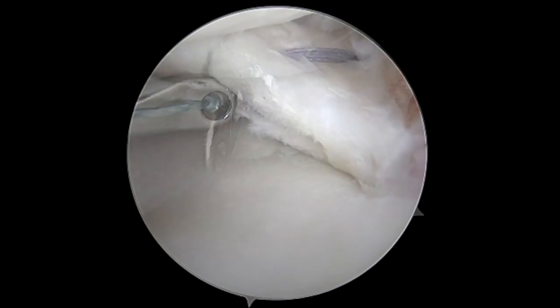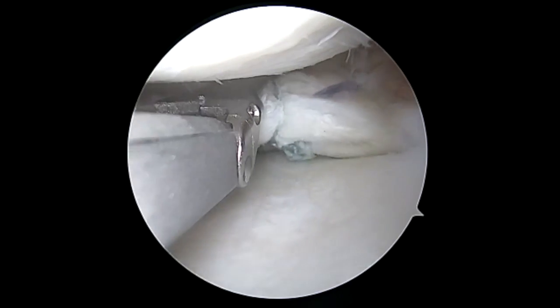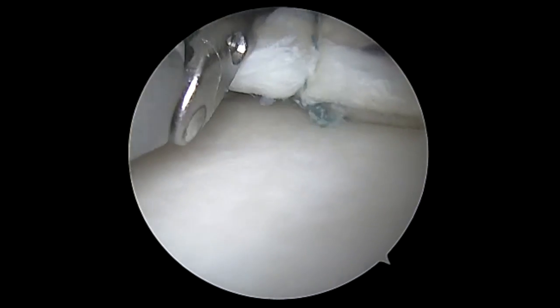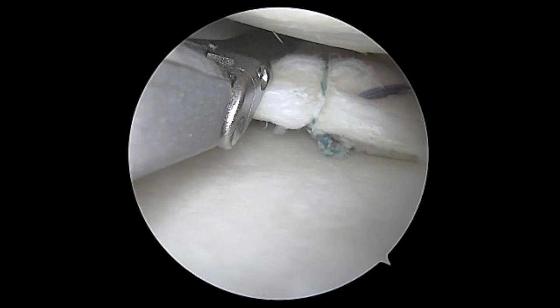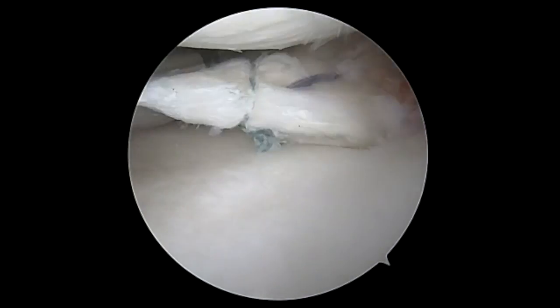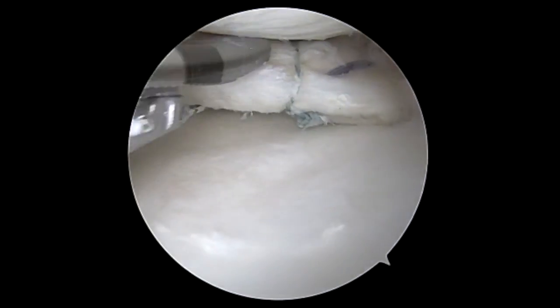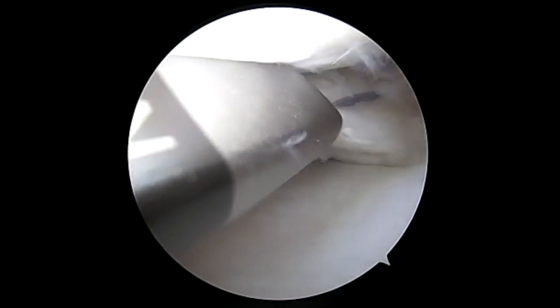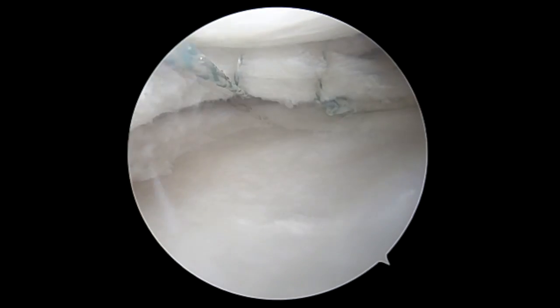And this compresses down the entire fragment. Following this, we replace this a second time as this horizontal component went through the entire posterior horn. Again, the trick here is to make sure that you get the passing portion of the system underneath the meniscus. And then we are coming out, and again, the nice thing about this is the contour and the needle does not hit the condyle. And now we'll do another round of alternating half hitches to compress this fragment back together and repair both the vertical and horizontal mattress components.